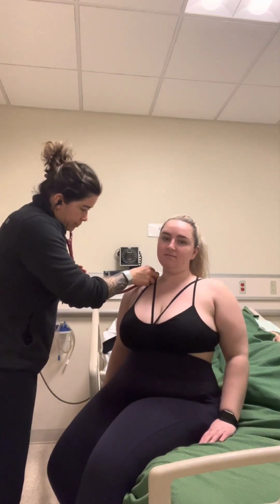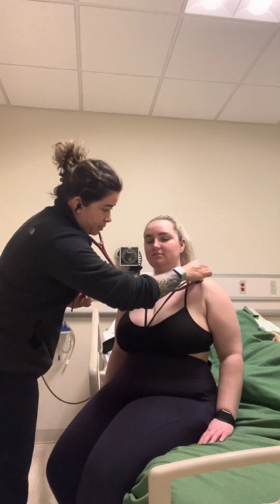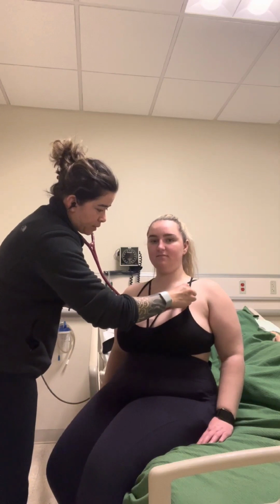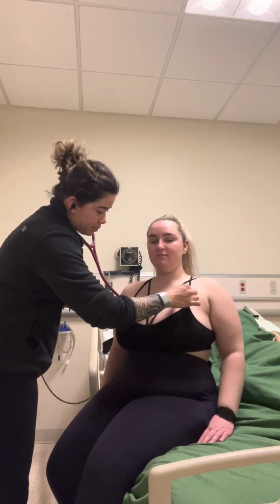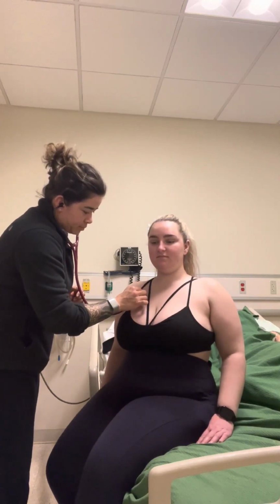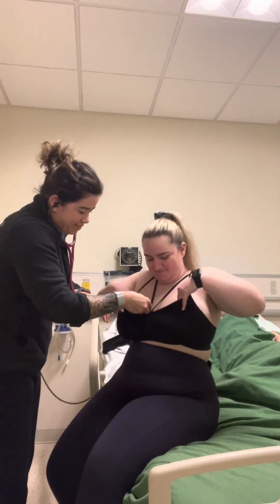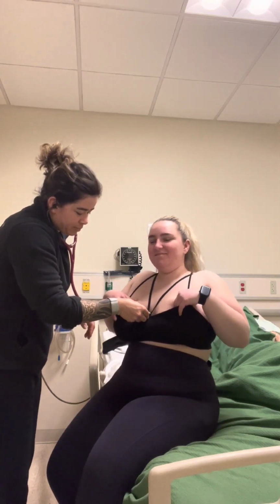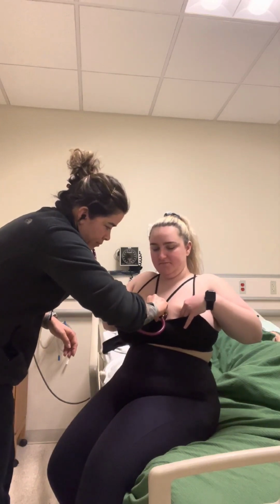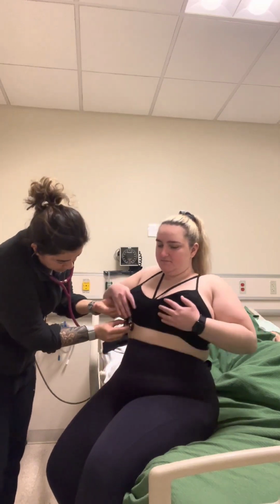Go ahead and take a deep breath for me. Okay. Deep breath. Okay. Deep breath. Okay. Deep breath. Okay. Just gonna squeeze it in here a little bit. Okay. Deep breath. Okay. Deep breath. Yeah. Okay. I'm gonna come right under here.